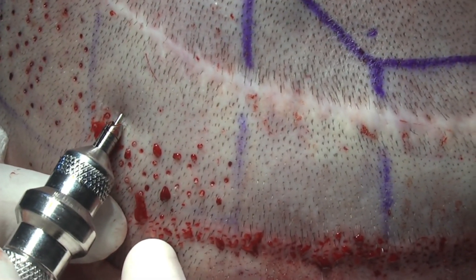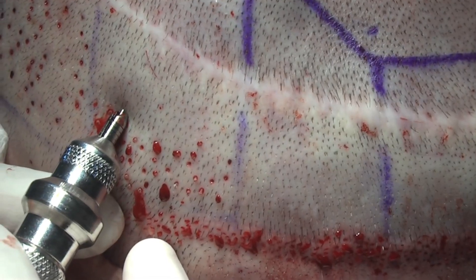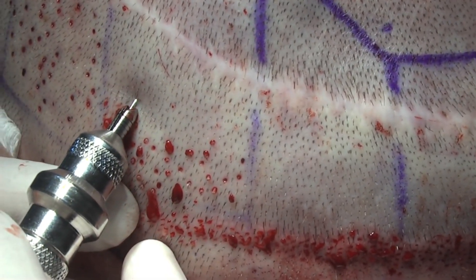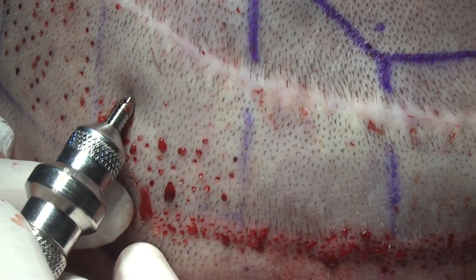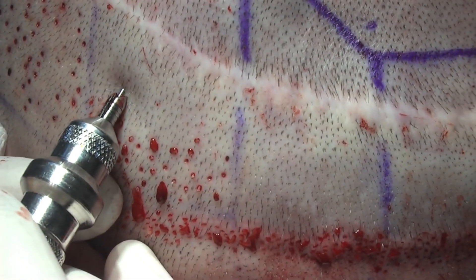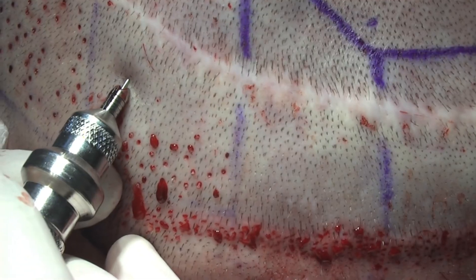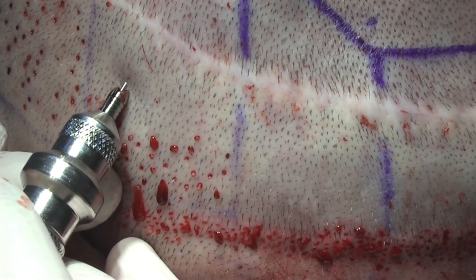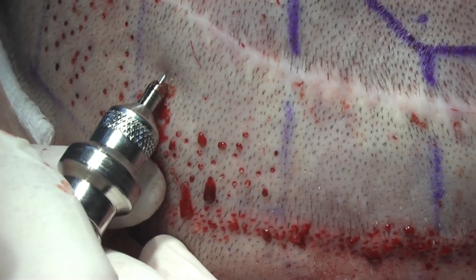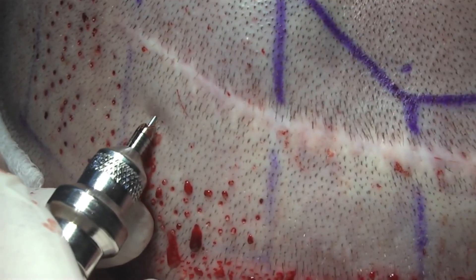Then I introduce the punch gradually into the skin. Once the resistance is gone, I am able to slide the punch directly down the axis of hair growth. In this manner, we get minimal to no transection of the follicles.